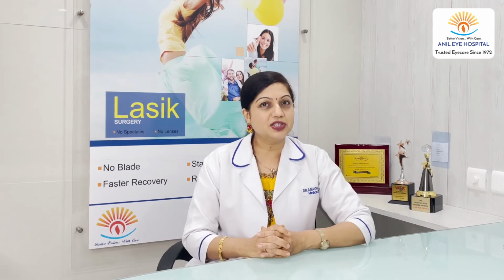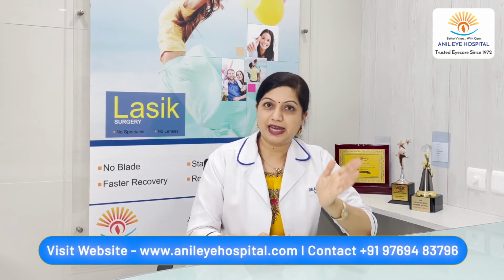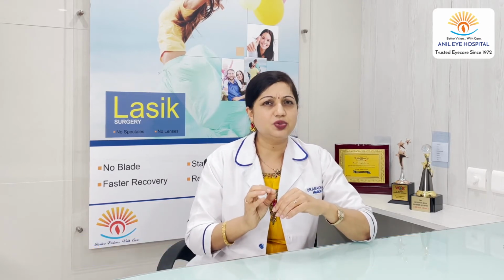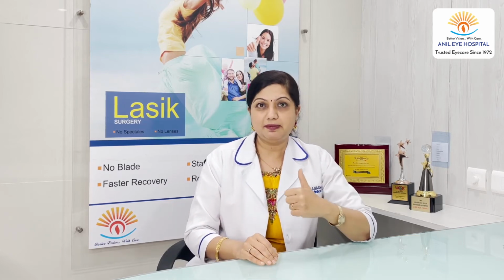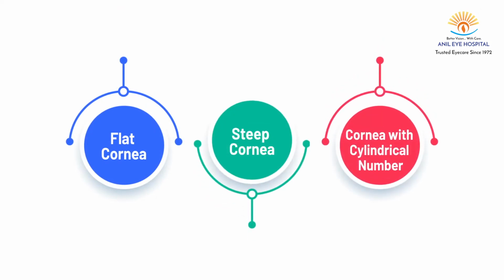Now the next question is, are both equally safe for me? Now when we use a blade procedure, we make a flap, and when we put it back, the making of the flap can have certain issues or certain difficulties in certain specialized cases. For example, if the cornea is very flat, or if the cornea is very steep, or if the cylindrical number is higher.